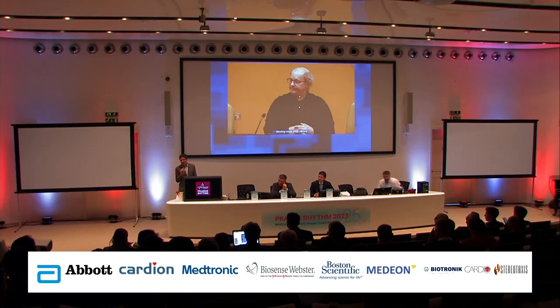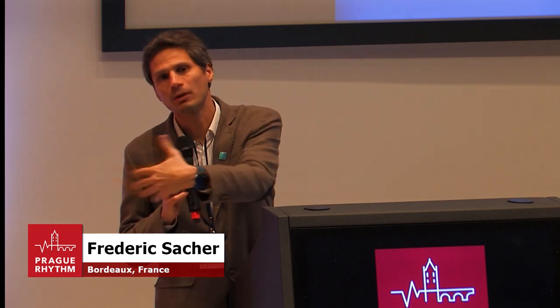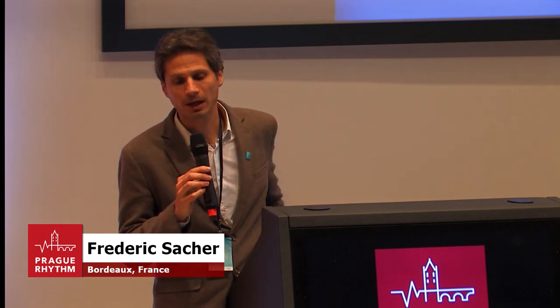Yeah, so thank you very much. This is quite a large question, and actually we could spend hours discussing that because it's great. First of all, it helps a lot and gives us an idea of the thickness. We are talking there about ischemic cardiomyopathy patients for this wall thickness heterogeneity. It's probably a little bit less reliable in non-ischemic, where it's intramural or there's less thickness, and we add other tools like late contrast and those kinds of things. But let's come back to thickness.